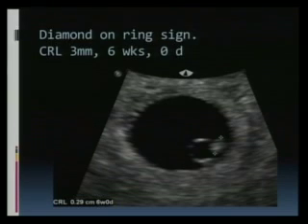Does that make sense? But there are some late bloomers, like some people just start late. So we give them a week or two to catch up before we render them abnormal. But for all practical purposes, the first time you see an embryo, in the majority of cases, you will be able to see a flicker. This is a very, very early embryo.